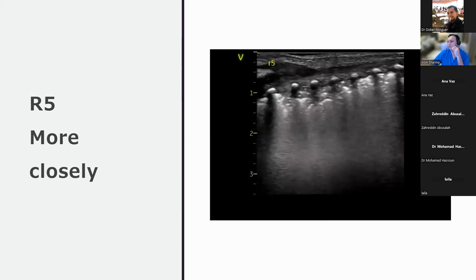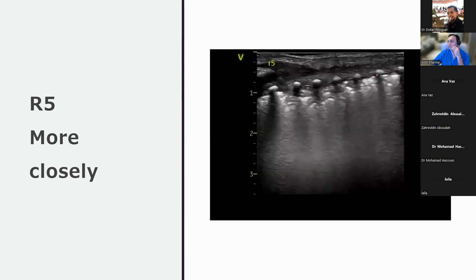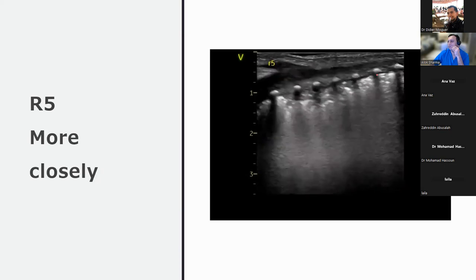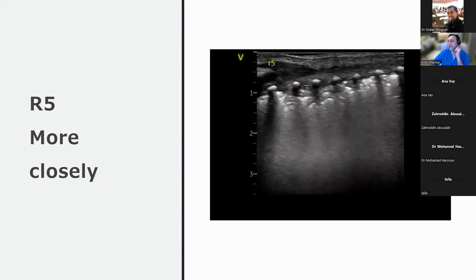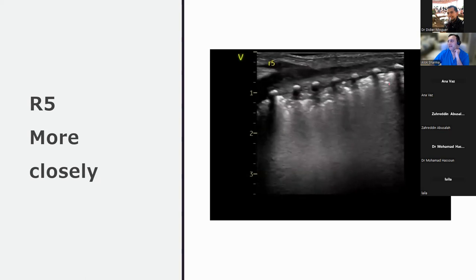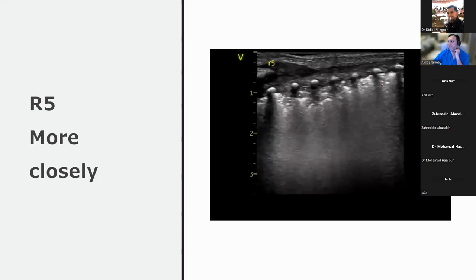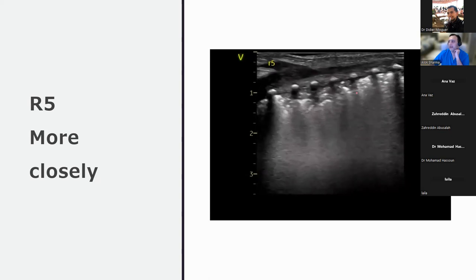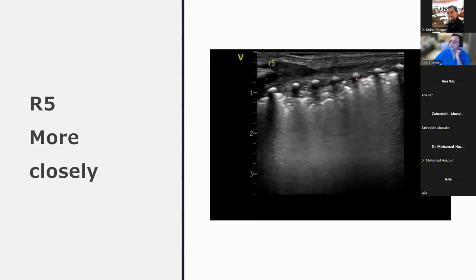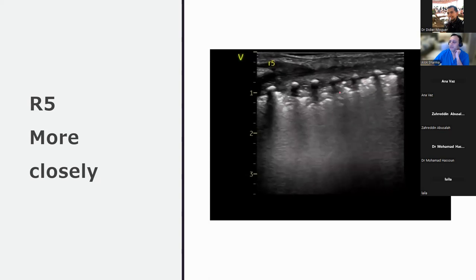I can't really see much of the pleural sliding at all because it's broken down. And deeper, there's lots of fluid, I guess. So you can see a pleural line here that is very irregular. You can see some consolidations there, subpleural consolidations. Those might be static bronchograms. Can you see those? Yeah. Again, now as you come here, can you see any pleura? No. And can you see how hypoechoic this margin looks?